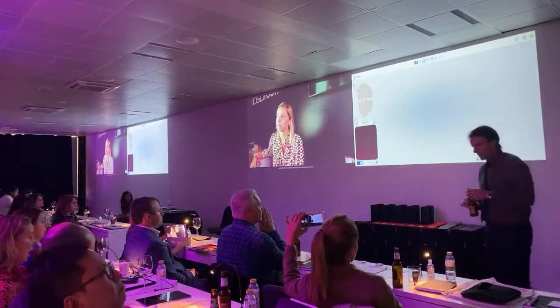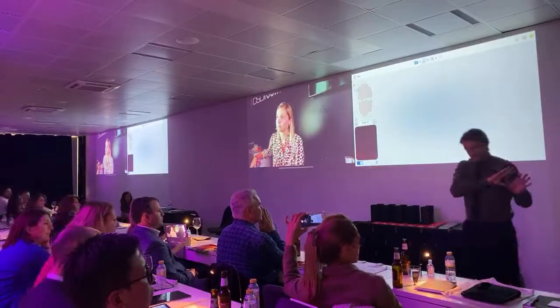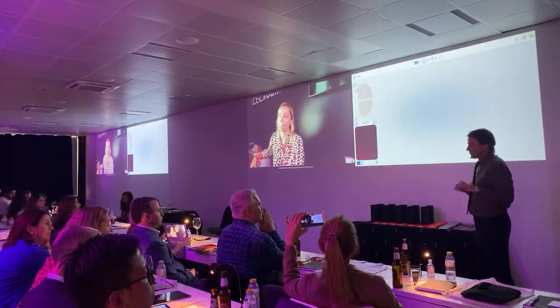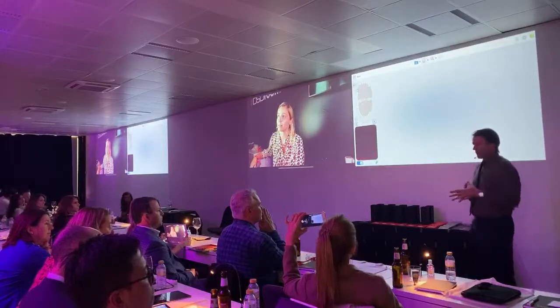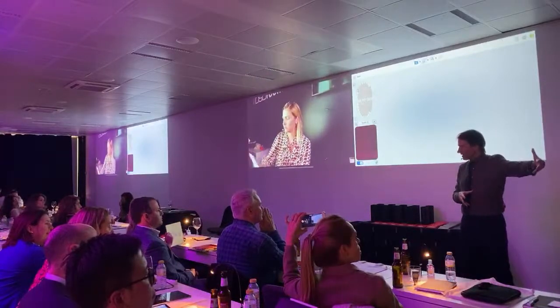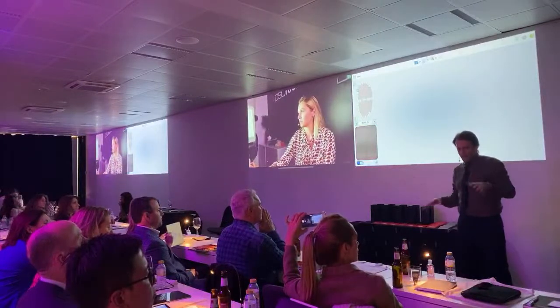Now, look at this tip. There's another tip. I don't know if you noticed, she gave another tip. The day of prep, you scan before prep. Why do you scan before prep? I already scanned before prep 3 months ago when I had the pre-op scan, right? I already did the DSD, I have the design. I prep, I scan my prep, we're going to overlap.